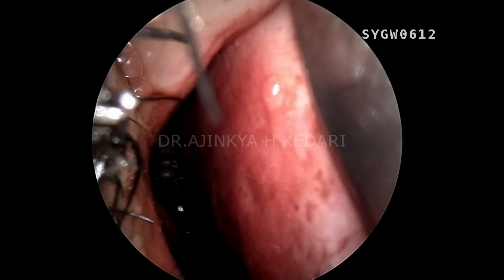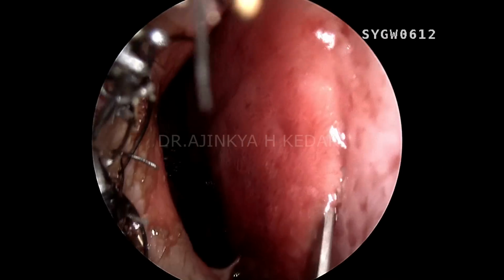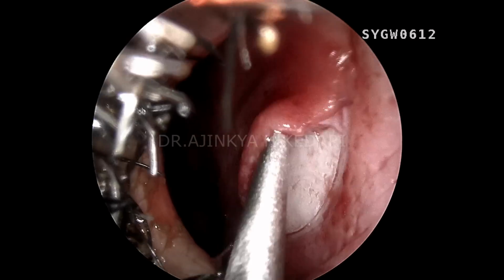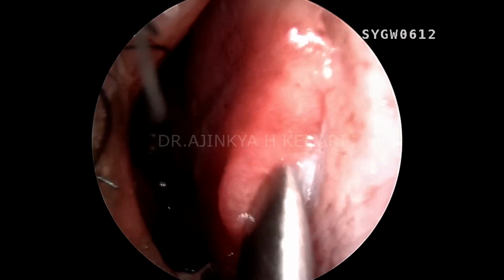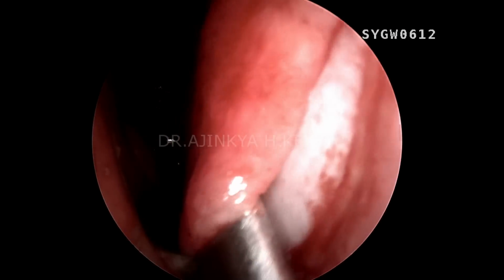Now coming back to the 0 degree, you can see I'm taking the Hadad flap right now, which I had not taken initially. I usually prefer to take it towards the end in cases of CSF leak, because I need to know how much of the area I need to close.